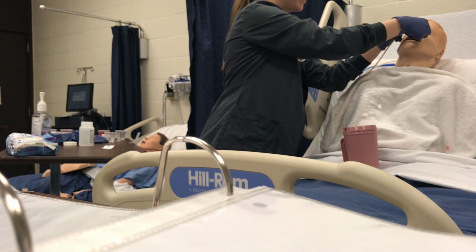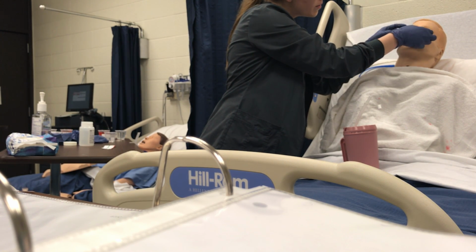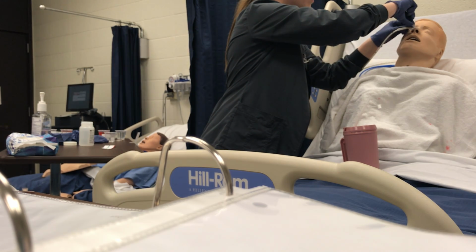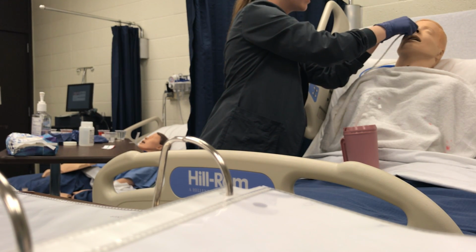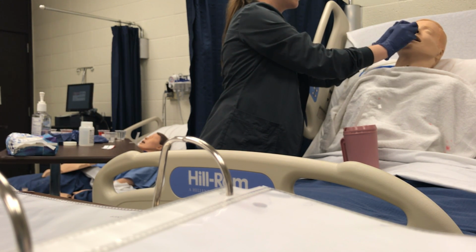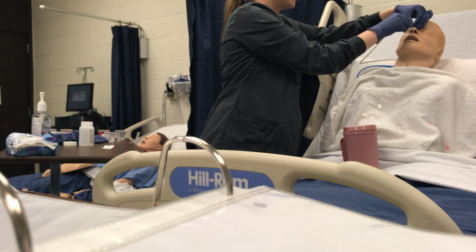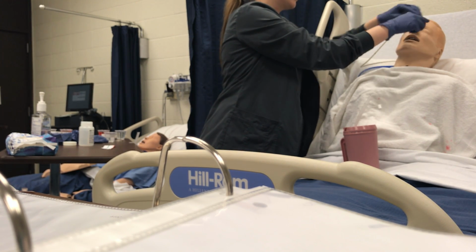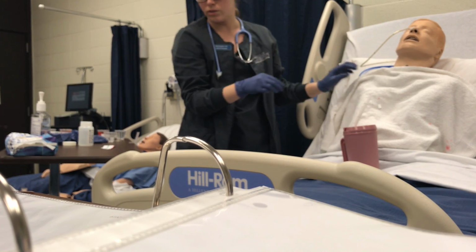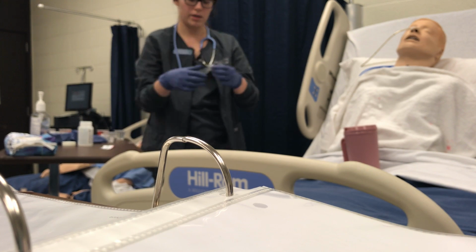So to do that, I have cut separate strips here, and we are going to just go around the nose, and come around the other way to make sure it was secure. So now that it is intact and secure, I would also secure it on to his gown.